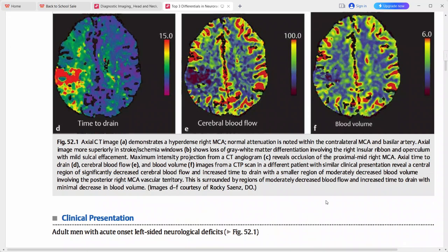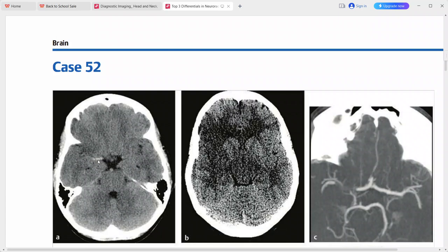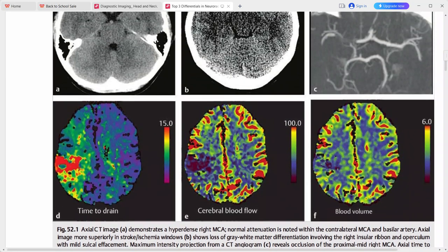This is an adult man presenting with acute onset of left-sided neurological deficits. Axial CT shows a hyperdense right MCA sign, with loss of gray-white matter differentiation in the right insular region and operculum and mild sulcal effacement. CT angiography MIP image shows occlusion of the proximal mid right MCA.